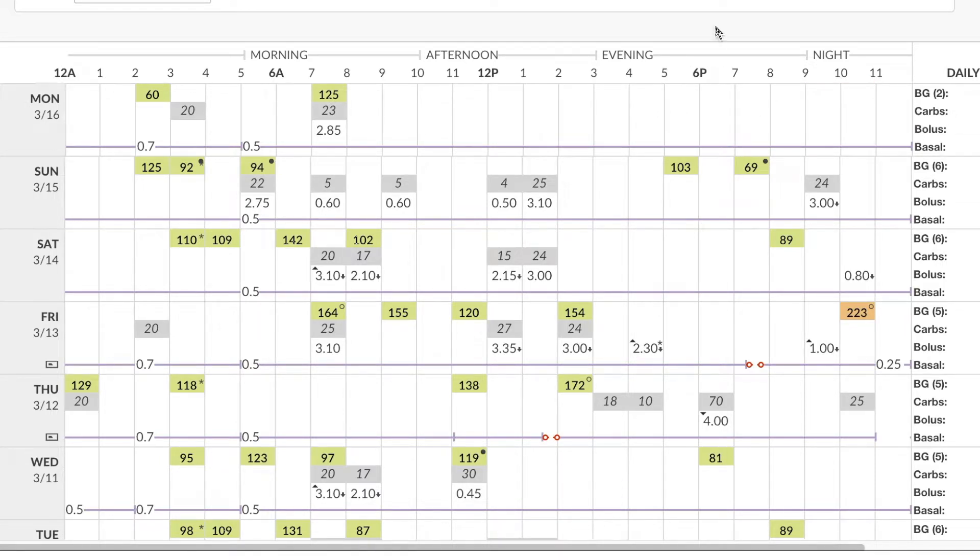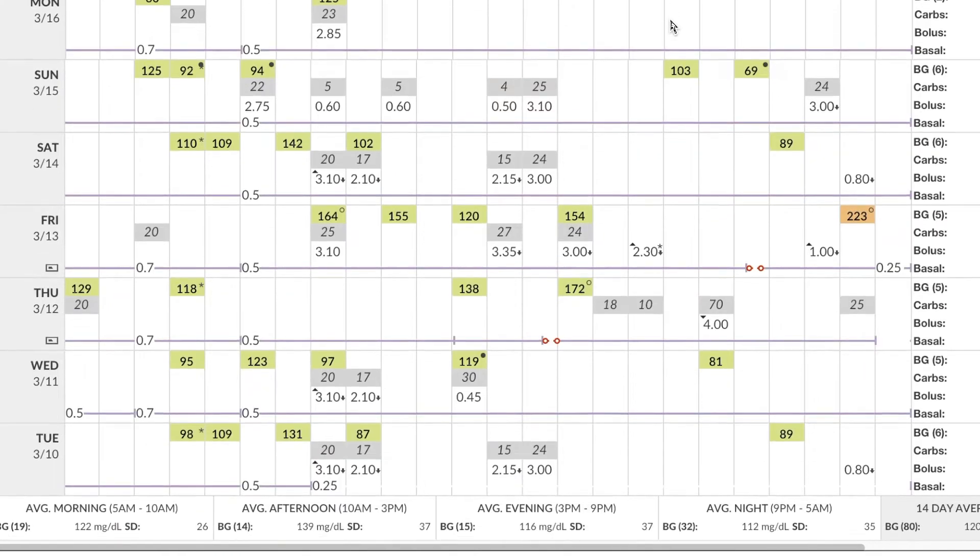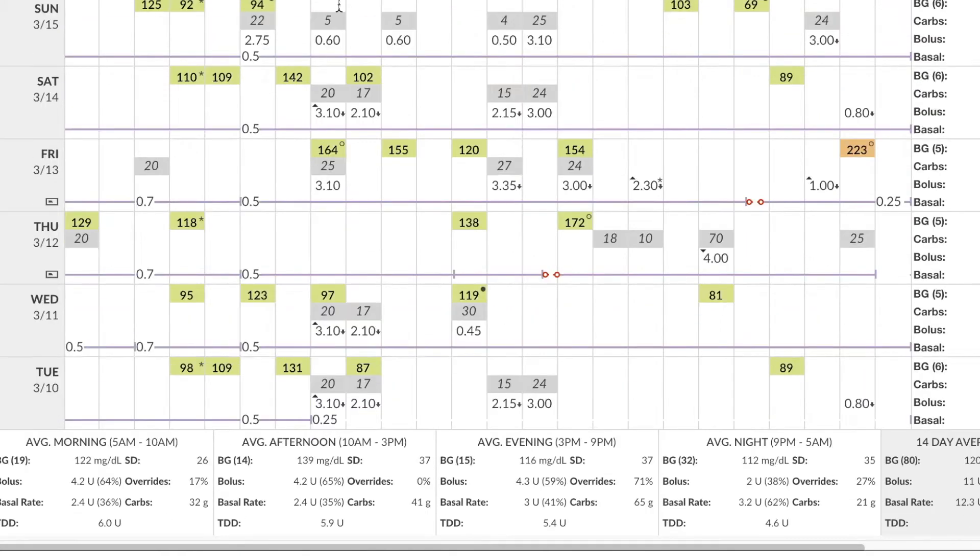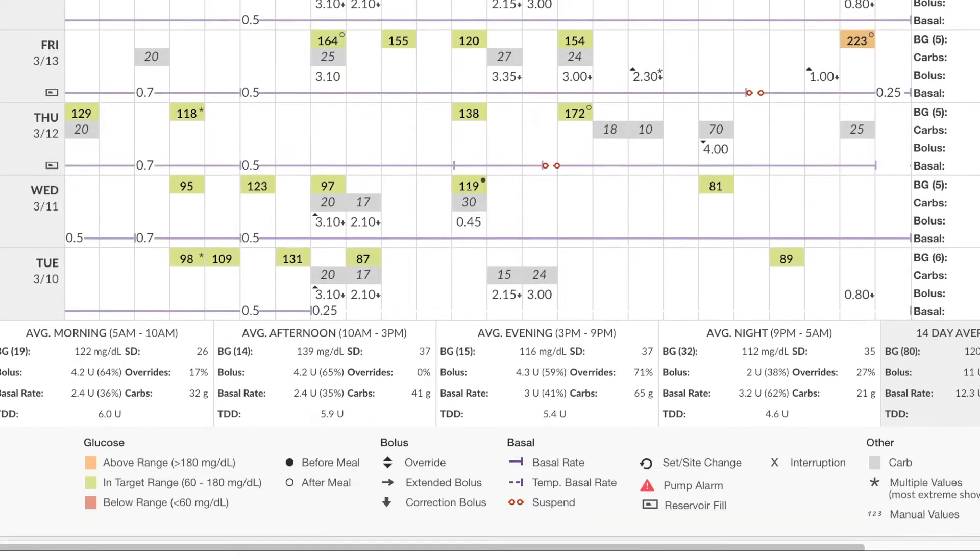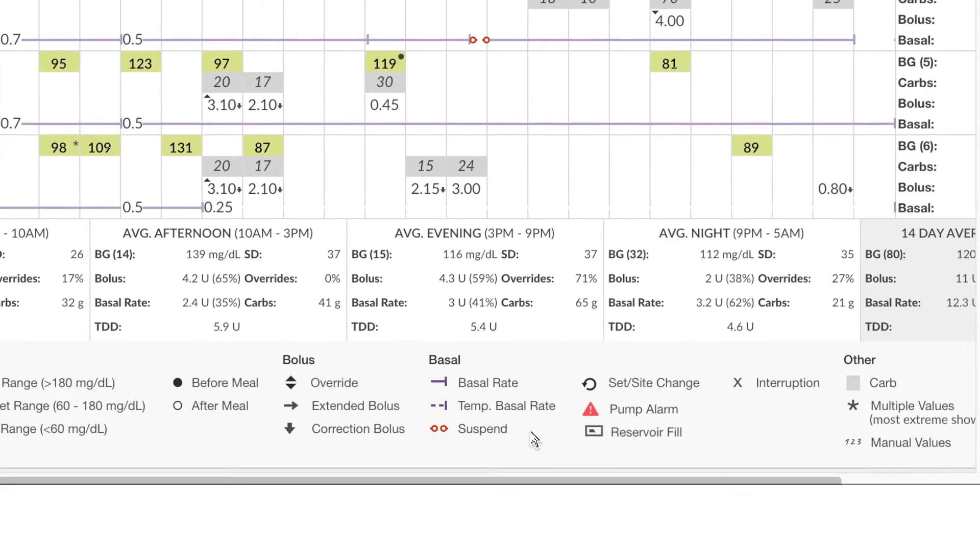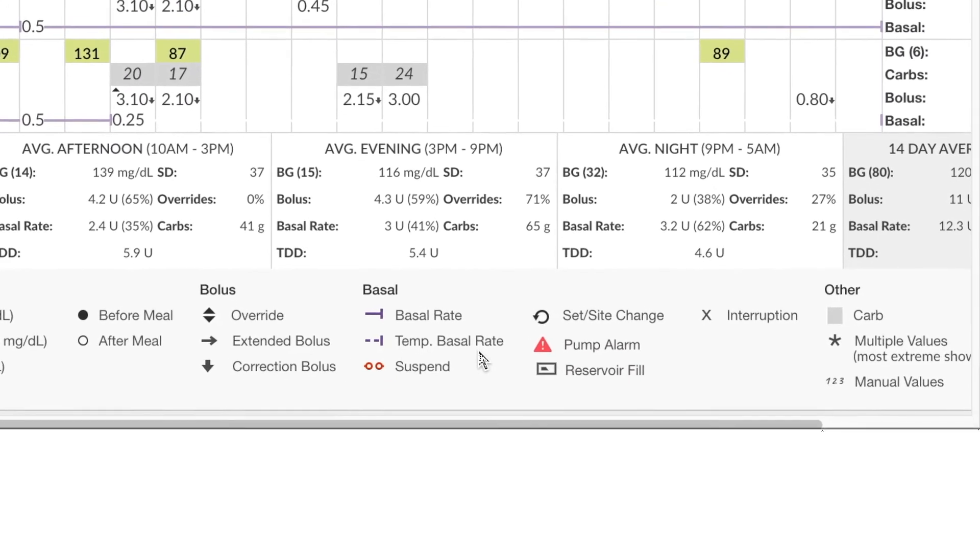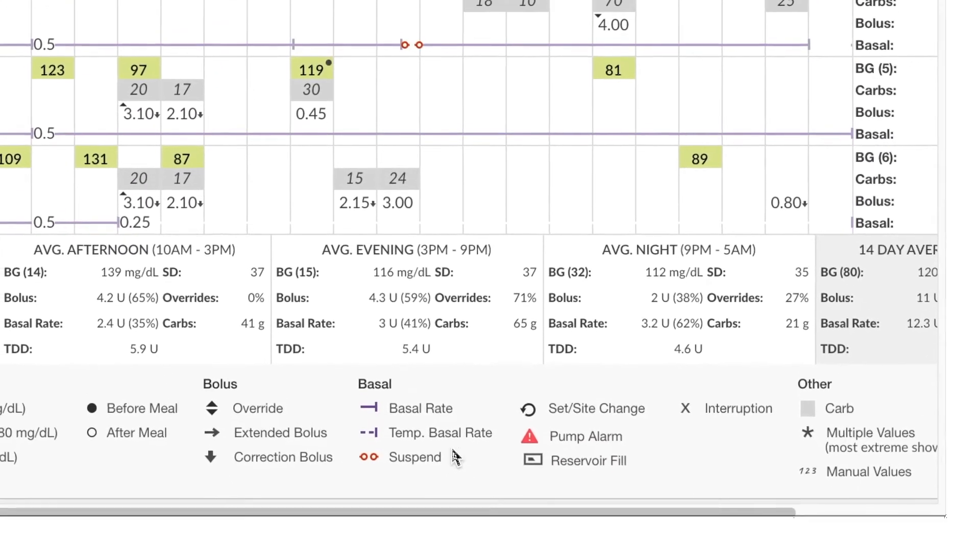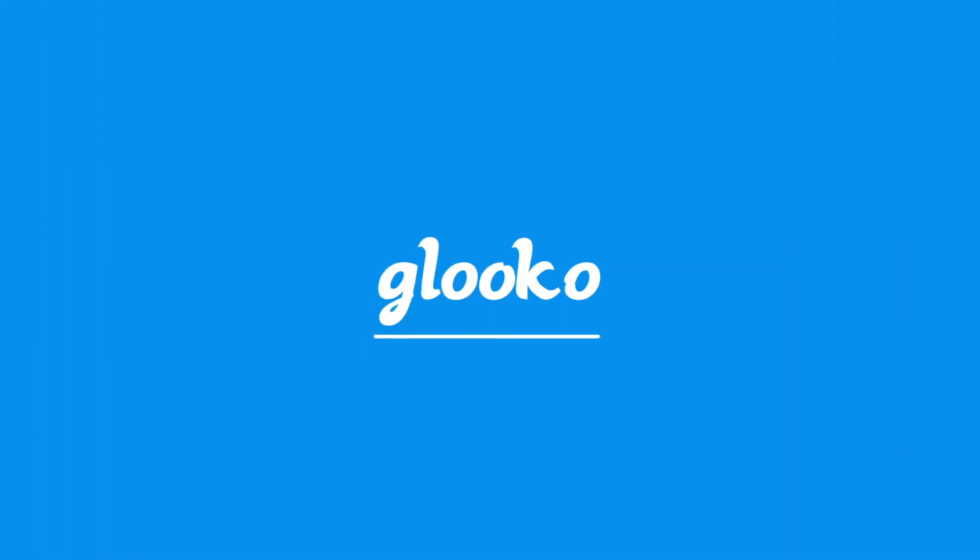If you have any questions about the icons within the graph, I highly recommend you scroll down to the legend at the bottom. It's going to tell you what the icon for temp basal rate is, for instance, or when there was a suspend on an account.